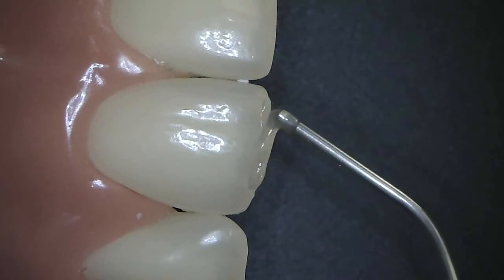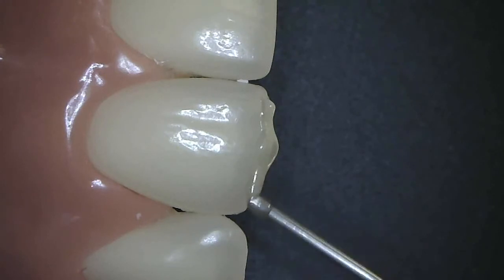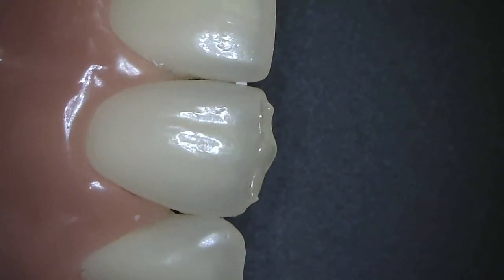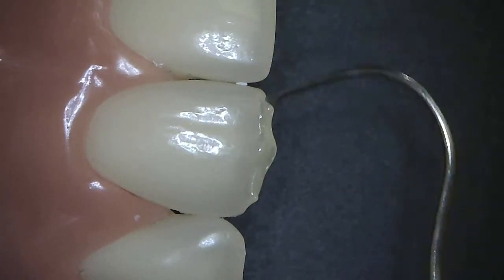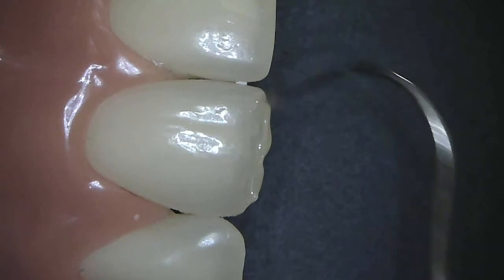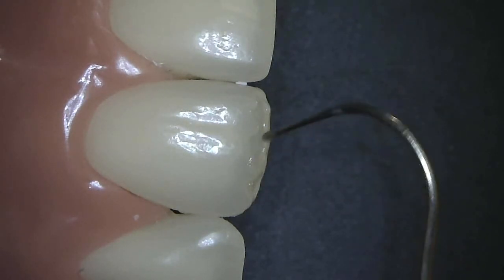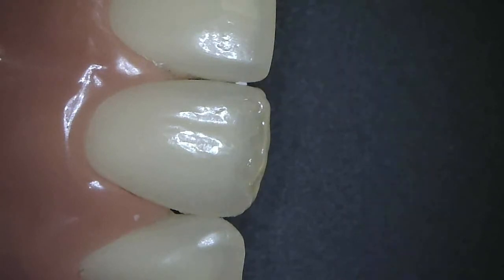Load the material a bit beyond where you'd like to end up, so you can finish with a disc. I will bring this material into position, feather edging it onto the facial surface as well as the lingual before I cure it.